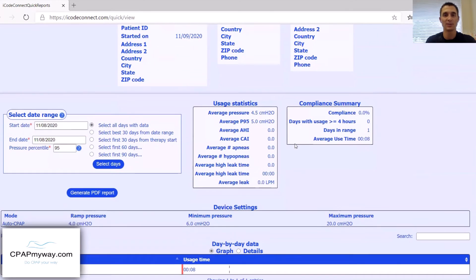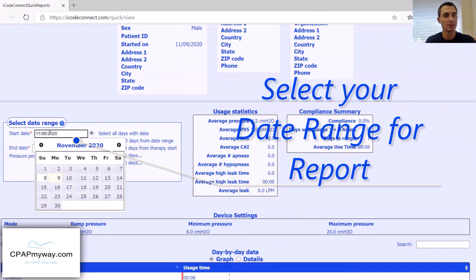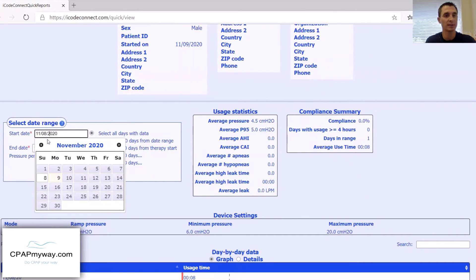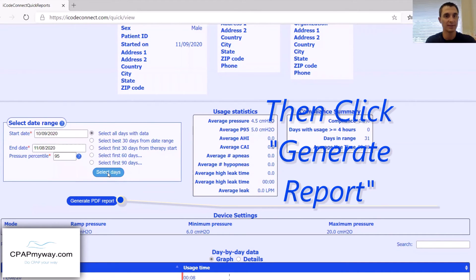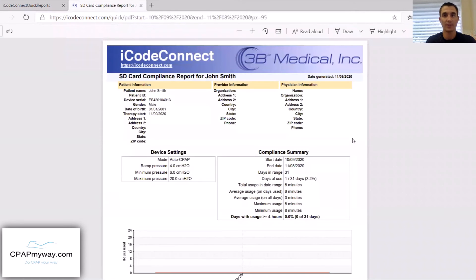What you're most interested in is getting a report you can take to your doctor or DOT clinic. You'll do that over here — select your date range. Most of the time they're going to want at least a 30-day report, so we'll do a 30-day here, basically the last month. From there, we will generate this PDF report. And there it is — that's your compliance report.